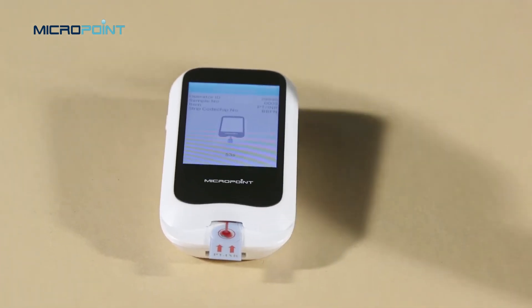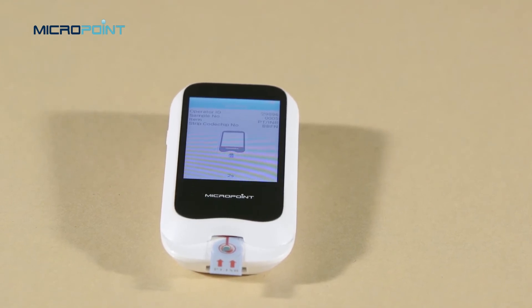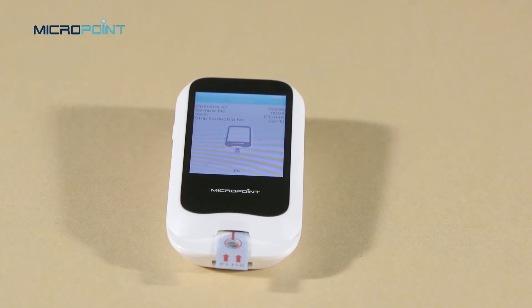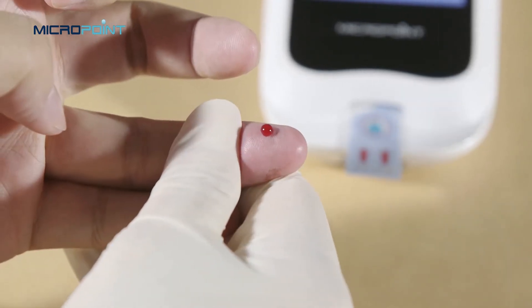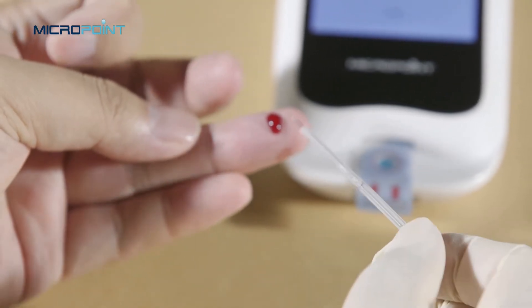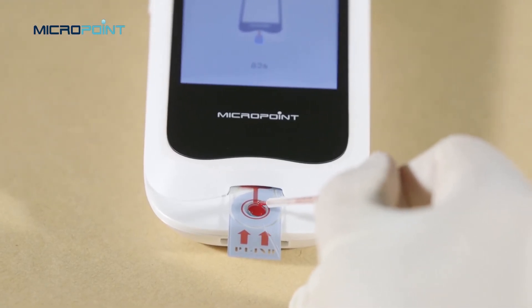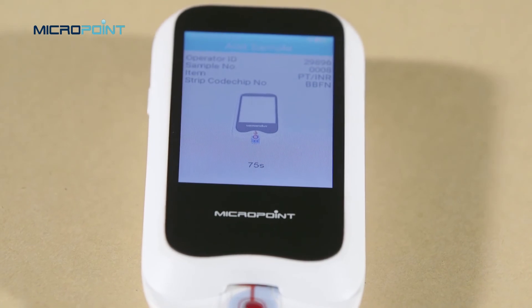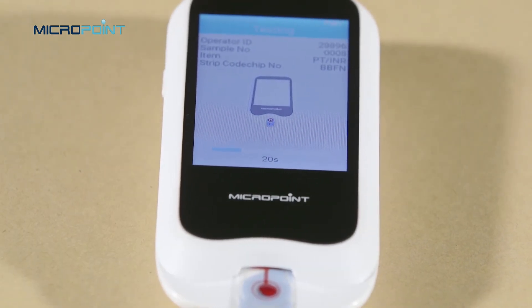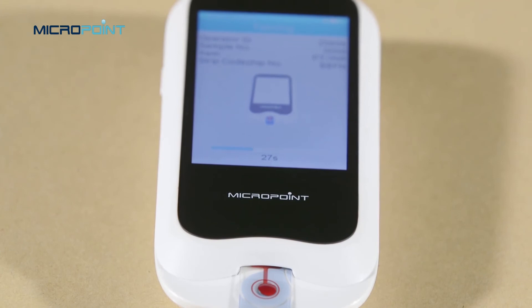Apply the blood directly on the sample well of the strip. The system will count down and prompt the user to add the sample upon completion of heating, and the sample must be added within 120 seconds. Do not move the instrument or your fingers during sample adding. You may also use a disposable pipette for the sample. The blood sample must be applied to the test strip within 15 seconds after collection. Q-Labs can use fresh capillary finger stick or fresh non-anticoagulated venous blood. After the sample is added properly, the system will start the test automatically and display the test progress.